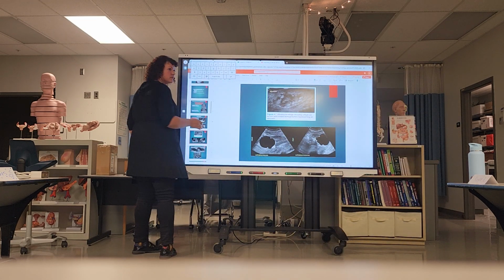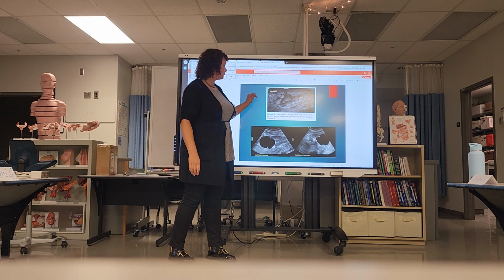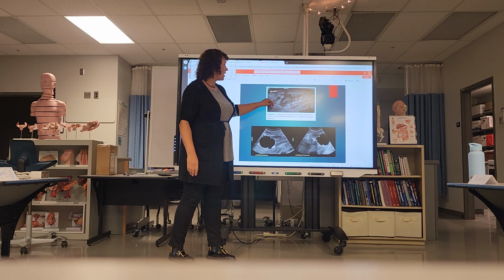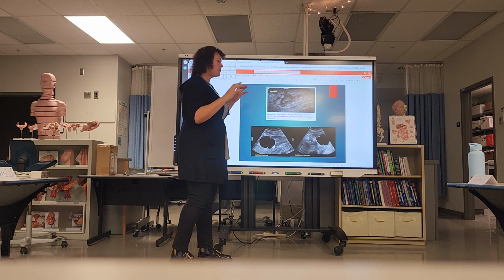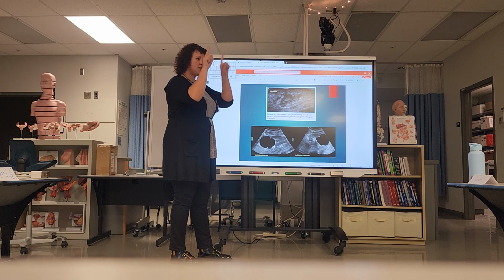Right there, it looks like it's going out from my angle, in that white part. It looks a little spiculated. Will it not? That's called a phlegmon. Spiculated, we're mainly going to use for a solid mass with spikes.